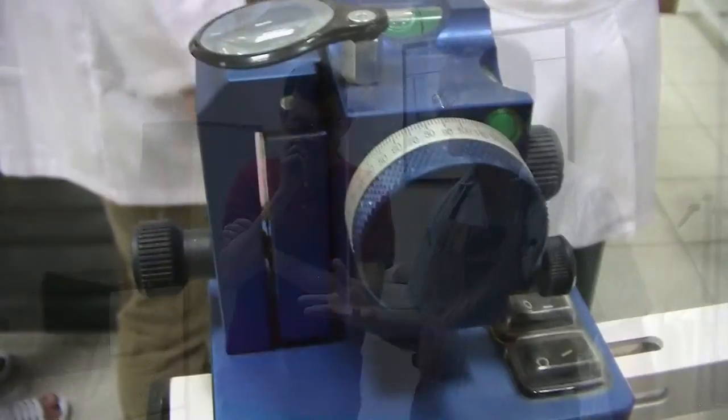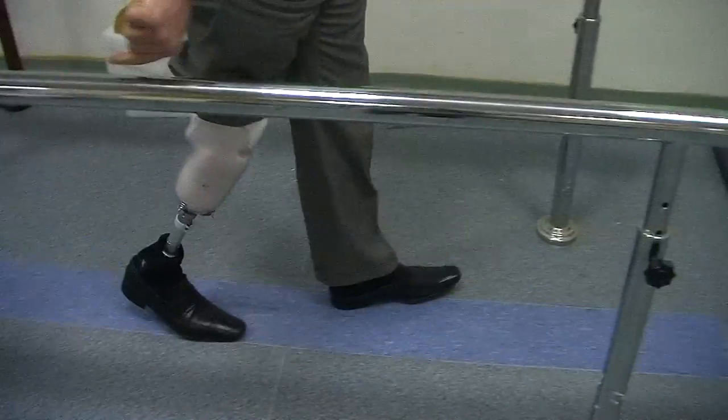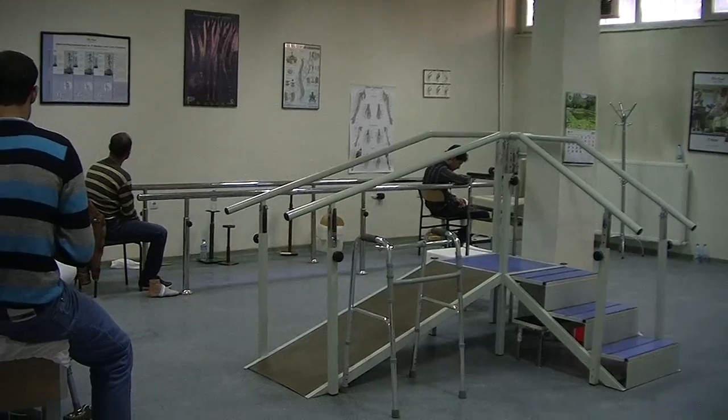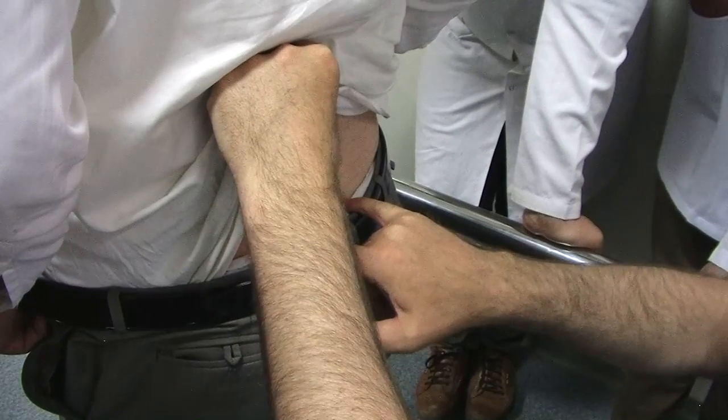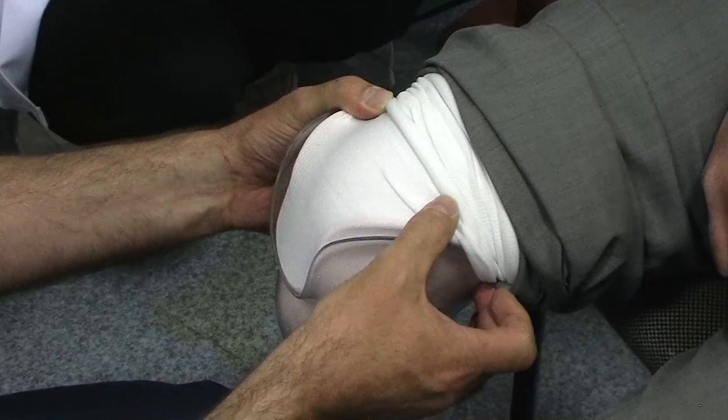The next step after we finish the alignment is to see our patients. I'd just like to raise some concerns: when working with patients, you must ensure a safe setting for the patient to stand up, especially when there is a temporary prosthesis.